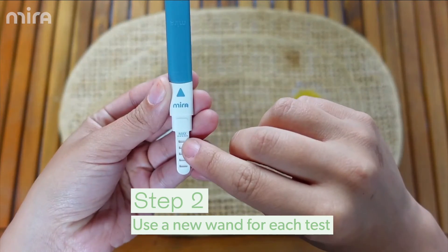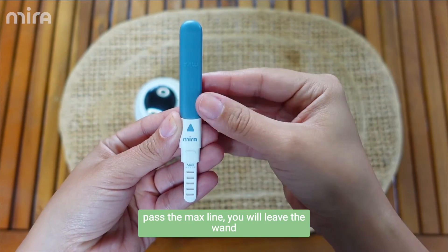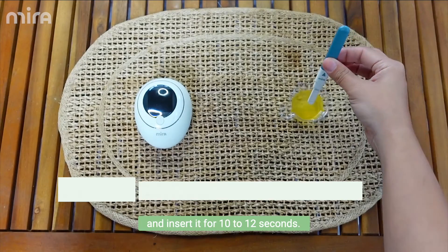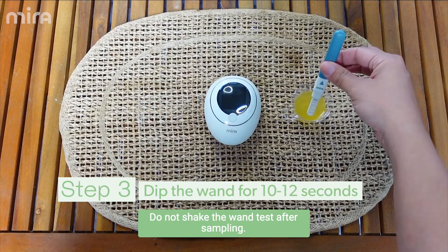You'll see right on top that it says max. When you dip this into the urine, you do not want to pass the max line. You will leave the wand inserted for 10 to 12 seconds. Do not shake the wand after sampling.